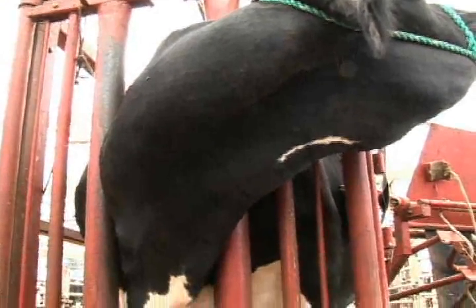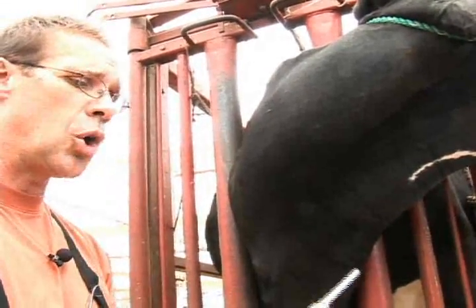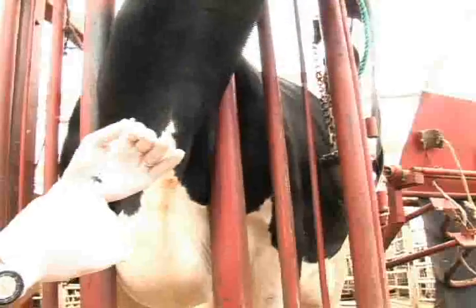Many times we're also required to give medication intravenously for our cattle in a large volume. We typically will use the jugular vein. I'm going to demonstrate administering medicine through the jugular vein.